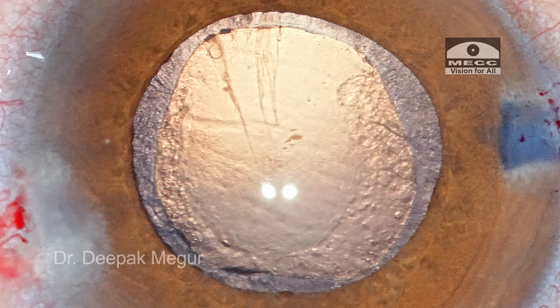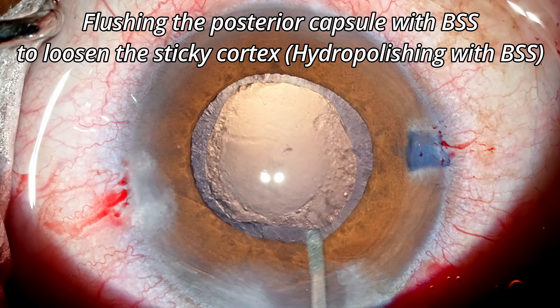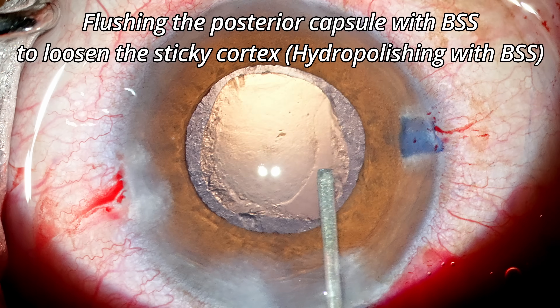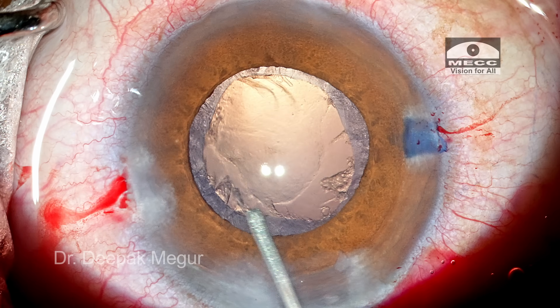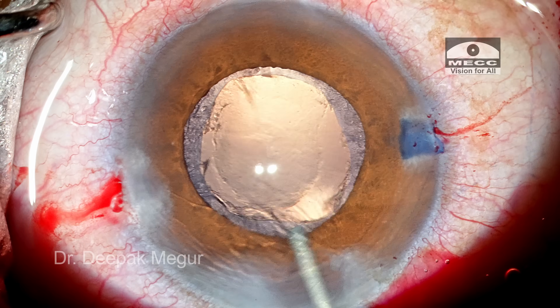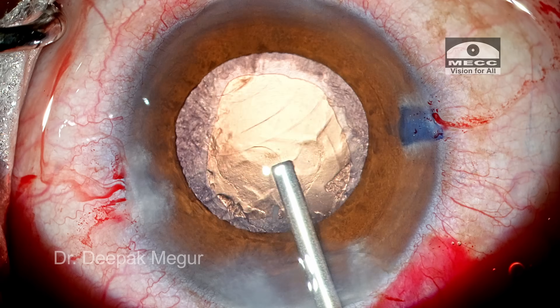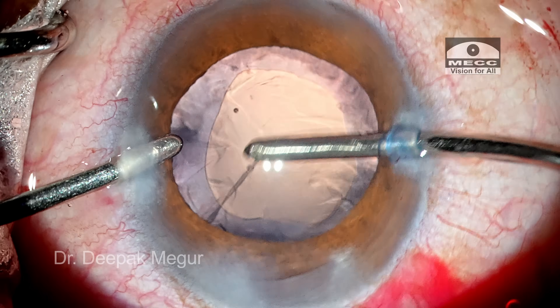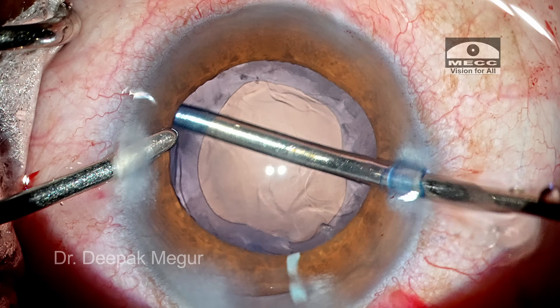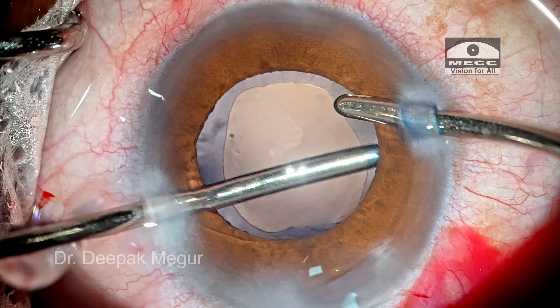We have a few cortical fibers remaining, and the remaining cortex in this mature cataract can sometimes be very tricky — they'll be sticking onto the posterior capsule. The best way to deal with it is to perform hydro-polish: squirt a little bit of BSS onto the posterior capsule, preferably by pressing down the posterior lip. This ensures adequate physical force to flush off the attachment of the fibers from the posterior capsule. Then go in and refill the chamber with OVD before removing these fibers. We need to be very gentle when aspirating this cortex.